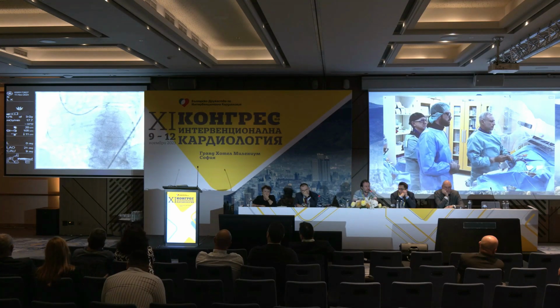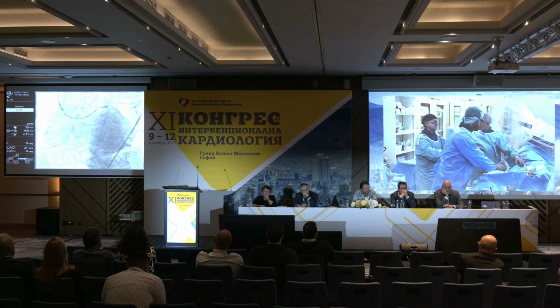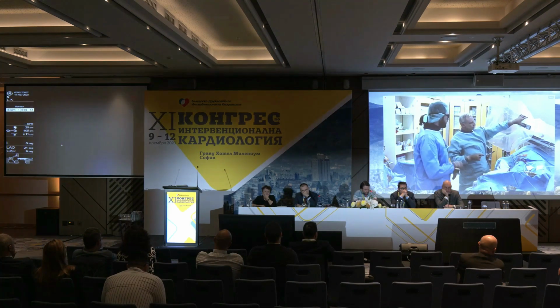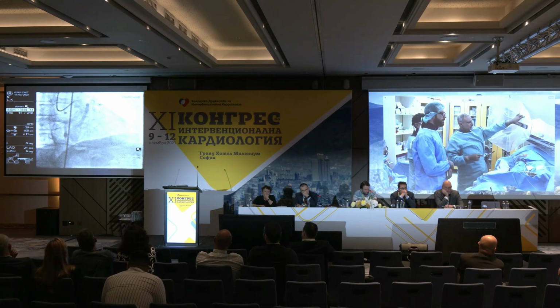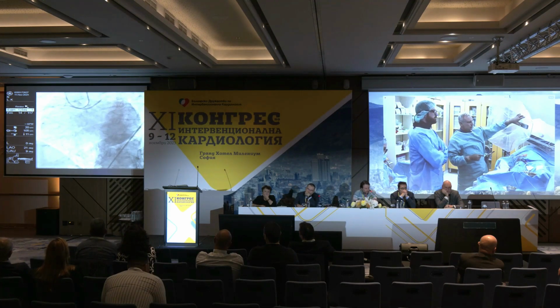We know, but you see also what is going on, because Dr. Gelef made a very nice comment before, which is very relevant now, and I'm going to show what we mean. I have underestimated that, to be honest with you.